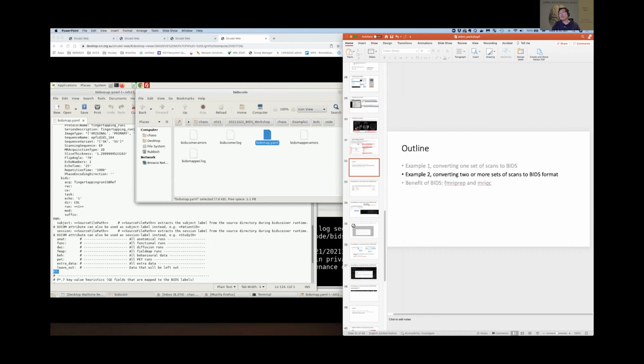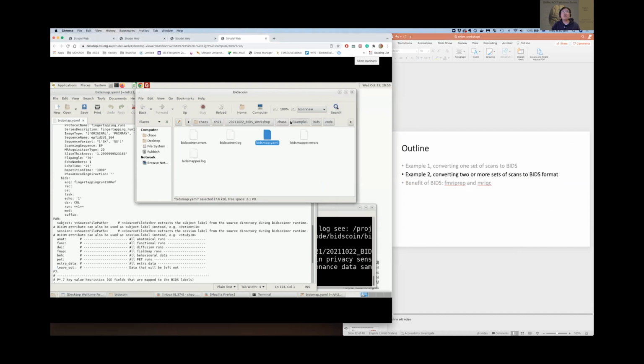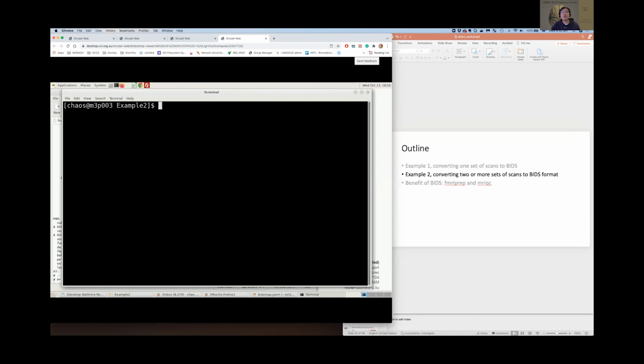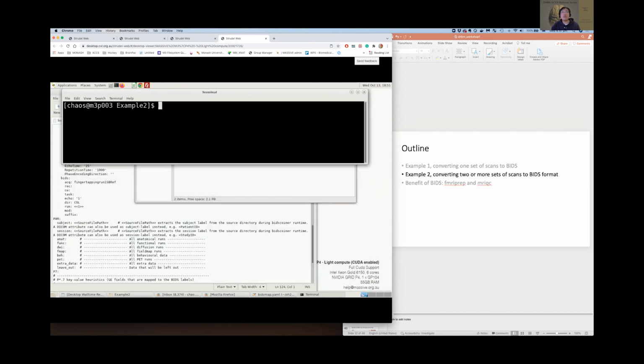Now I'm going to the second example. In the second example, I have two sets of data. Once you use my prepared data and unzip example 2, when you open it you will see this. You go to the DICOM folder and you've got two folders. You open it and there are 496 DICOMs in there. Okay, let's forget about this one and start a new one. Again, I'm here in example 2. I open a new terminal. Okay, I'm going to do exactly the three steps that we did before.